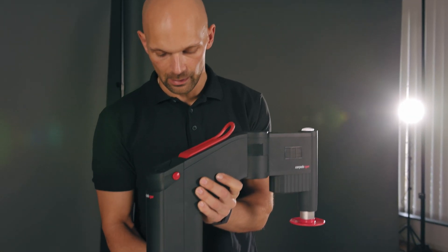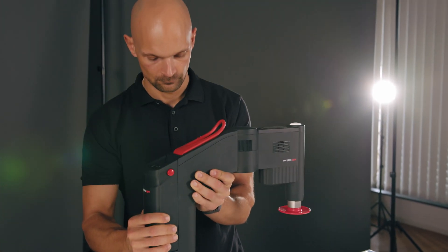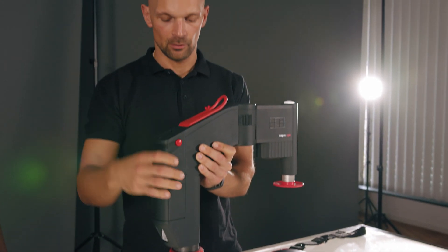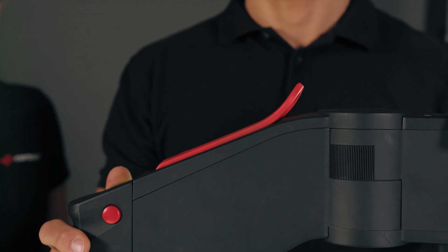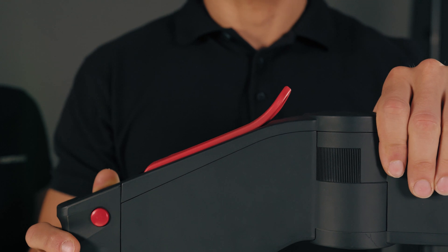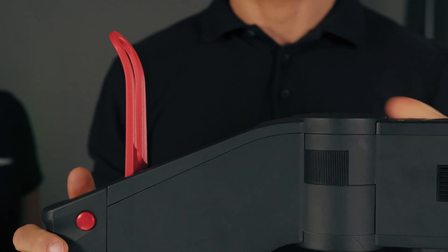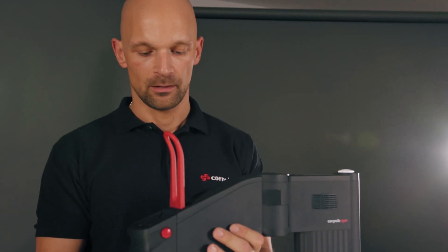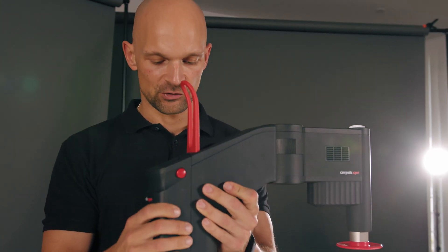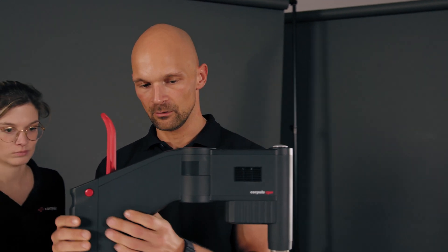To loosen it, turn it once and lift it upwards. To avoid tilting, always make sure that it is placed vertically. The second operating control is the locking lever. To open it, it is advised to place one hand on the front of the device and then pull it back firmly. The various joints can only be moved when the locking lever is fully open. Especially when adjusting the height, make sure to hold the Corporal CPR at the back to avoid tilting.